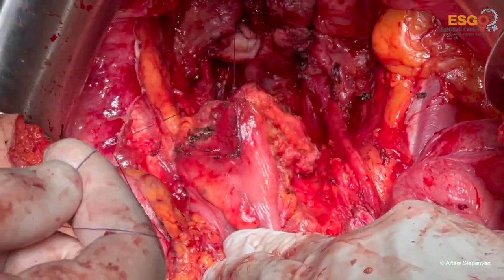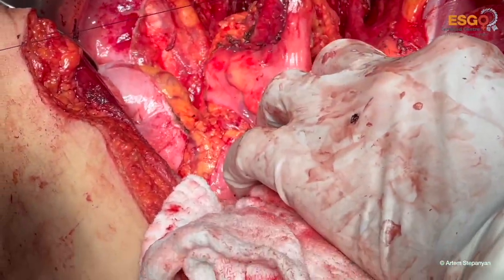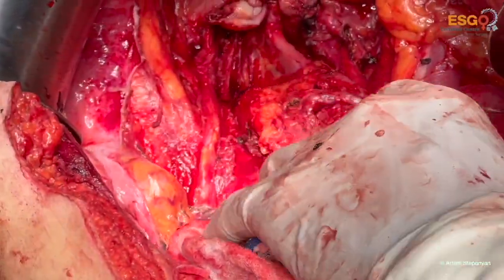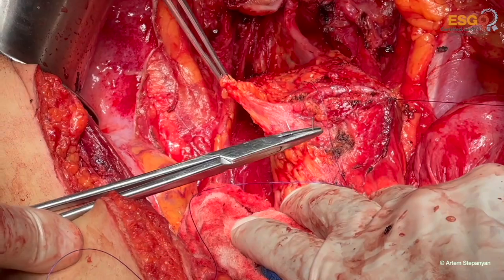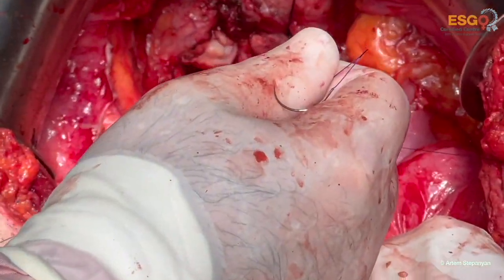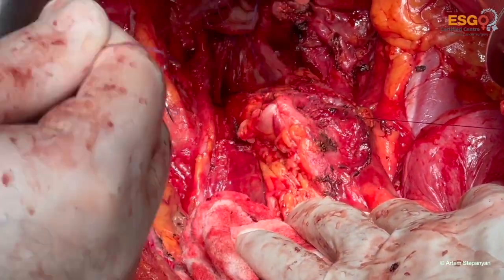Due to the shaving, we have some defect on the muscularis of the proximal rectum and distal sigmoid, and the muscularis is restored by a series of interrupted sutures. You see the defect. We put a couple of stay sutures on the left and right sides of this defect, and then we will close it.